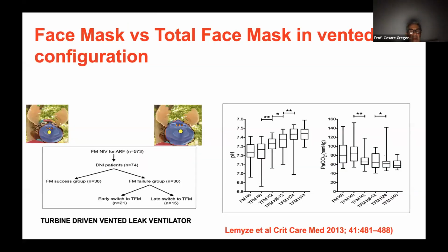Anyway, going back to the real clinics, there is a very well-known study led by Lemyze in Critical Care 2013. In this study, his group used a turbine-driven ventilator in DNI patients. The aim of the study was to demonstrate that the earlier you switch from the conventional oronasal mask to a total face mask, the less the risk of skin breakdown.